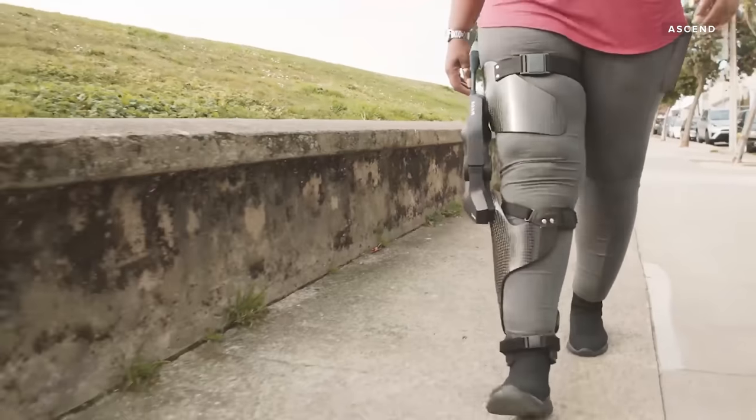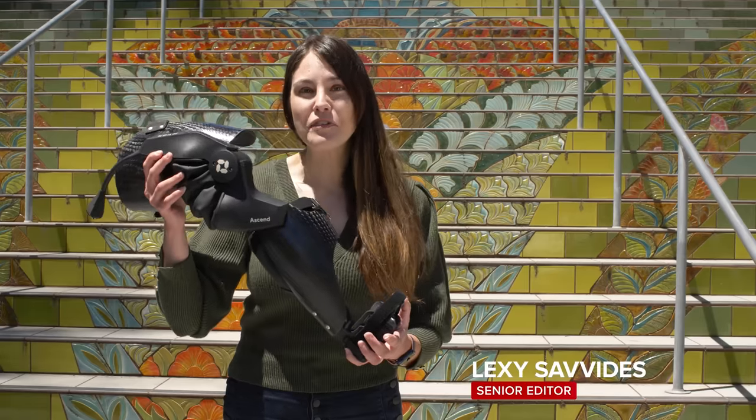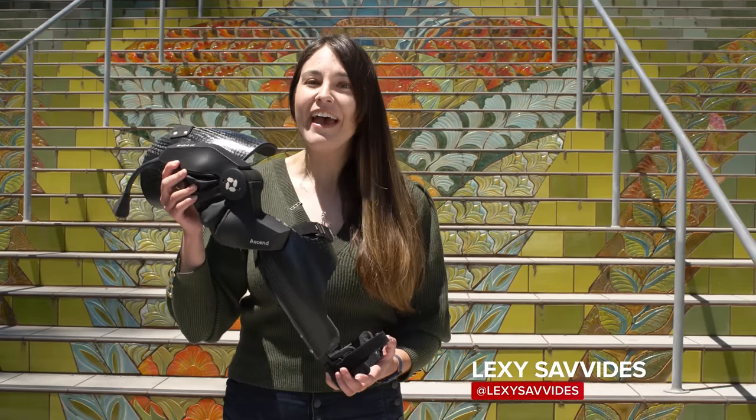If you're one of the millions of people who suffer from knee pain, you'll know it can be debilitating. This is the Ascend from Roam Robotics, and it's a wearable robot that can help relieve your pain and maybe help you avoid surgery.